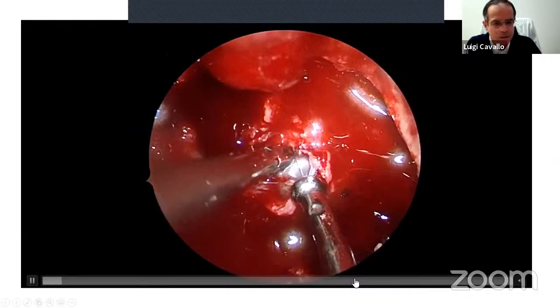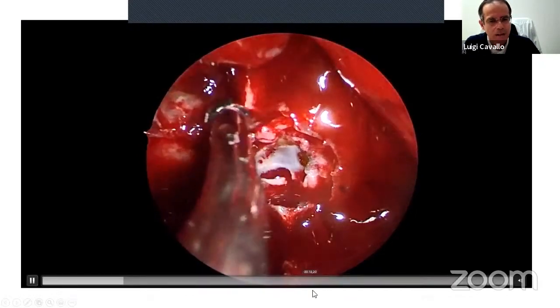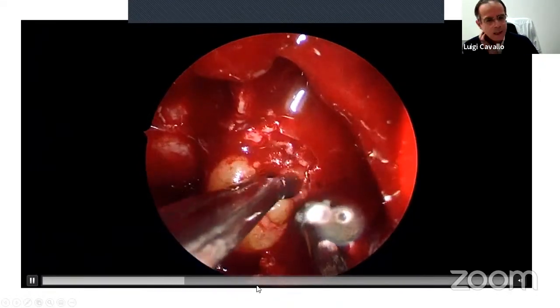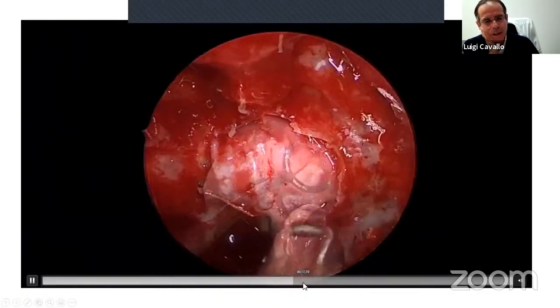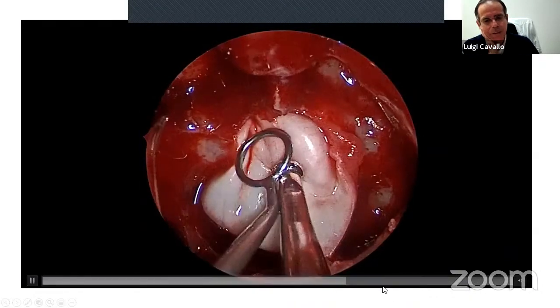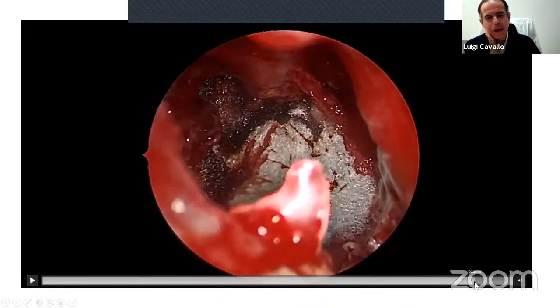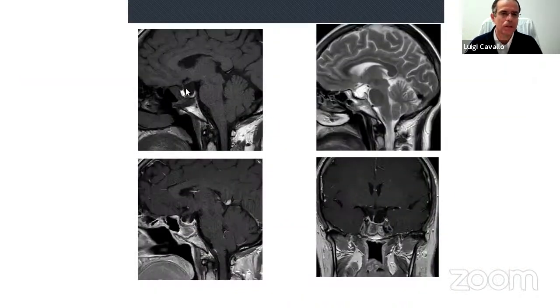But you know what happened? This patient had a post-op CSF leak. And in fact, this was a communicating arachnoid cyst. This time, we filled the cavity completely with fat, and then again with the dural substitute, we covered with the mucoperichondrium and packed the sphenoid sinus cavity with fibrin glue. And you see the post-op control with the piece of fat.